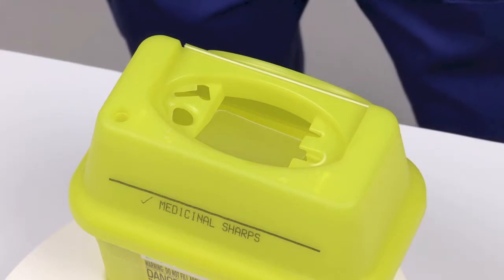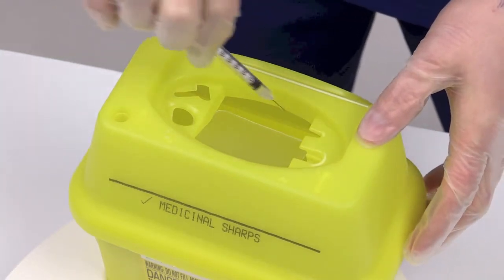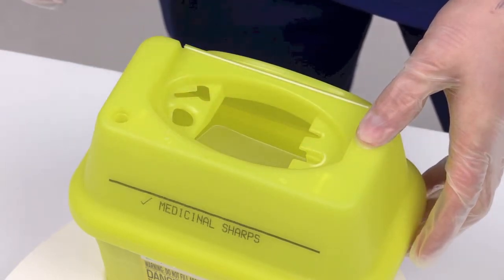Dispose of sharps into the SharpSafe container by simply placing the sharps through the open aperture, activating the container's internal flap. The flap returns to the closed position once the sharps have passed through.